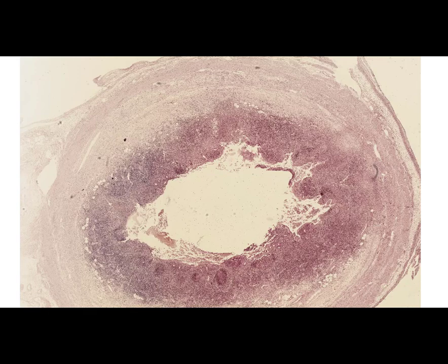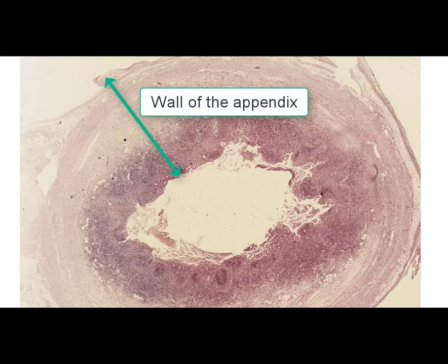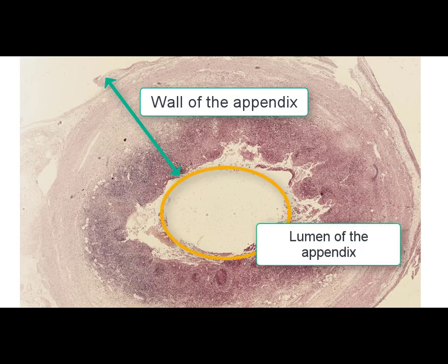Generally, phlegmon is a diffuse purulent inflammation which doesn't have clear boundaries and which can occur not only in subcutaneous adipose tissue or spaces between muscular fascias, but also in the wall of the hollow organs such as the appendix. As with any other form of suppurative inflammation, a hallmark or main criterion is the predominance of polymorphonuclear leukocytes or neutrophils in exudate. At low magnification, wall of the appendix and its lumen can be seen. Lumen is partially filled with a purulent exudate.